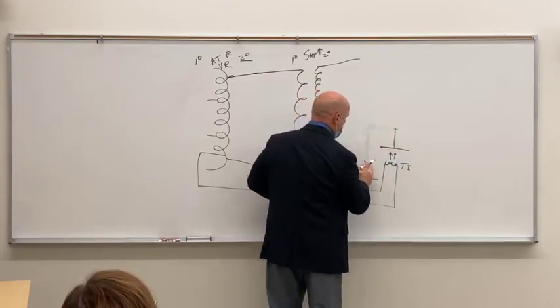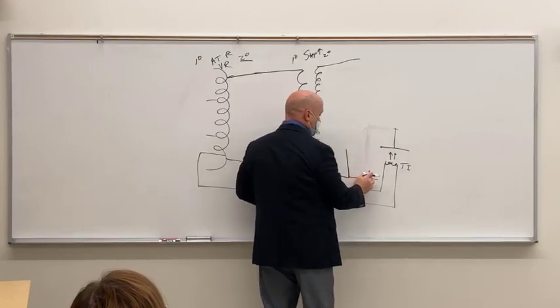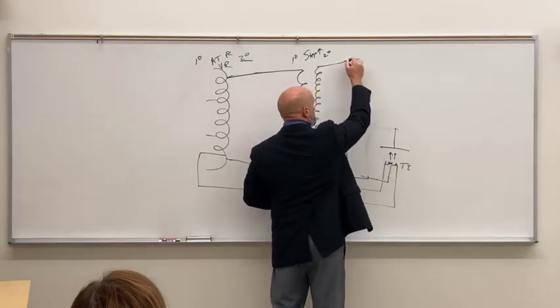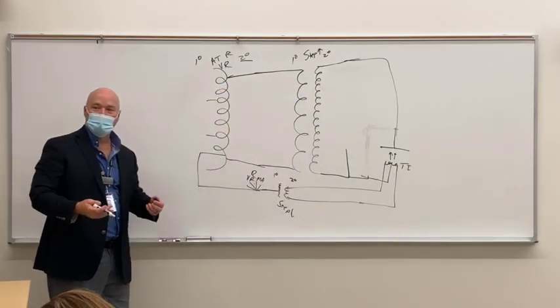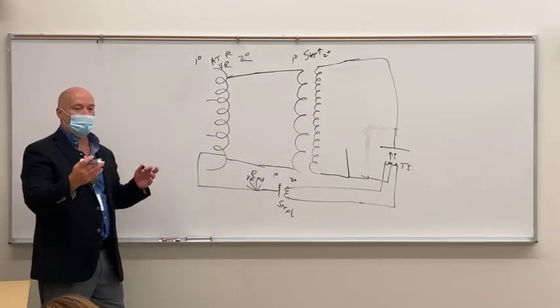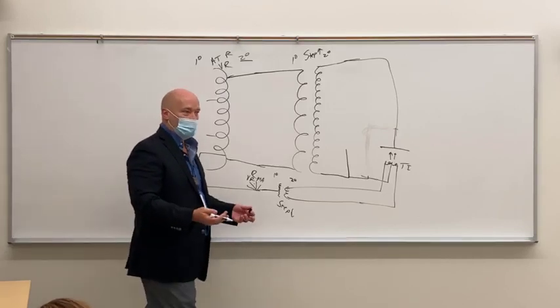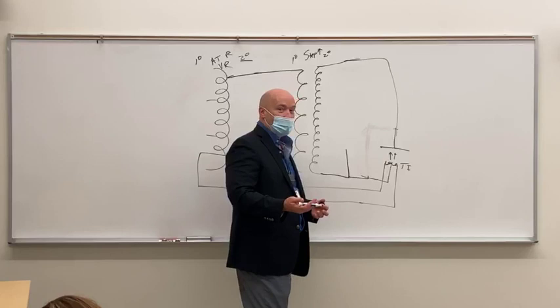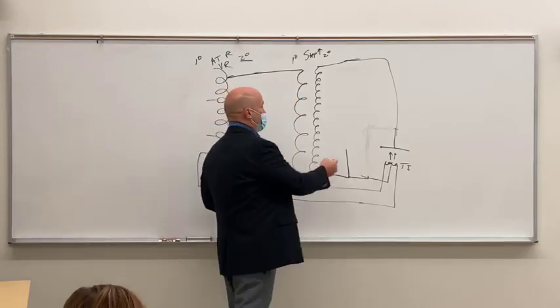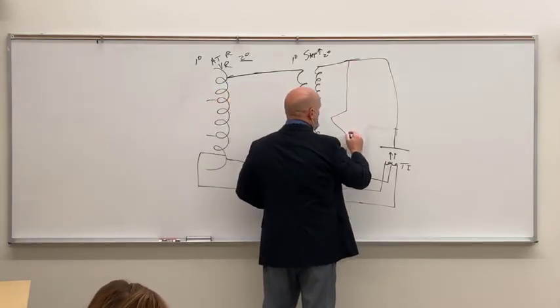What does it go into after it comes out of the high voltage transformer? Problem, we have alternating current, we want direct current. How do we fix the problem? We rectify the problem with rectifiers in this case, right? So how many rectifiers are we going to have?